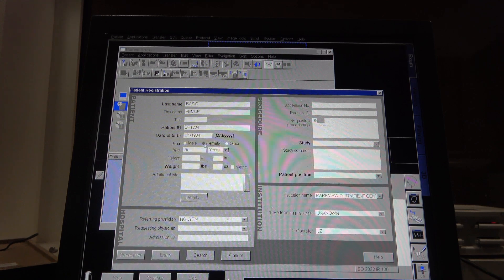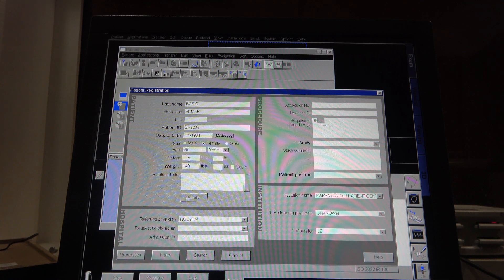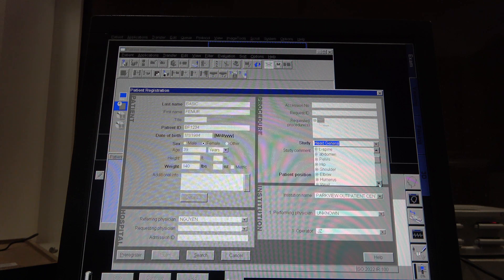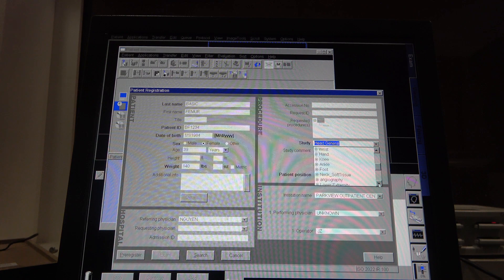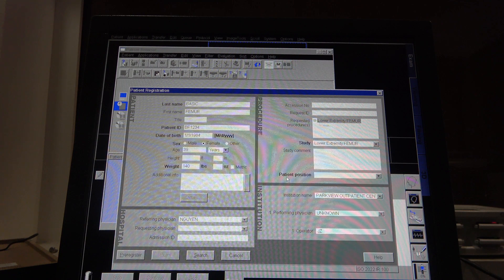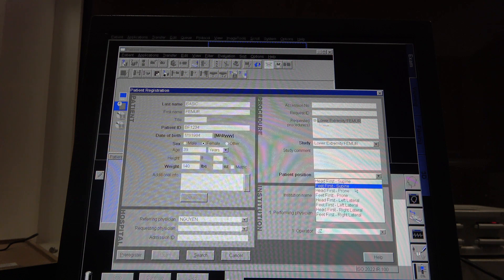It's going to be a female, weight: 140. And we have to pick a study. Every facility is different — some will have knee, ankle. Here they have it under Lower Extremity. You just click the plus sign and you get Femur, and we're doing a femur. Patient position: we're going feet first, supine.